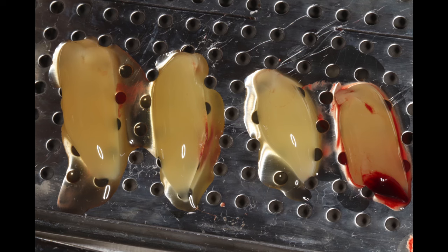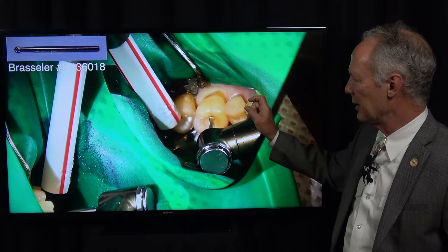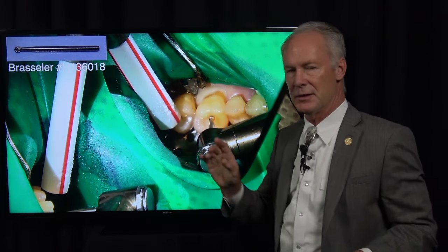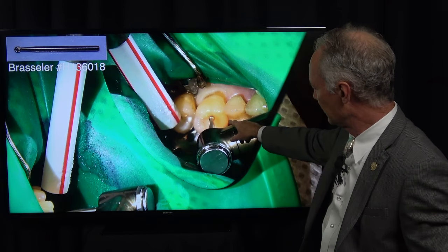You put the platelet-rich fibrin clots on this perforated tray, then put the lid on top of it and it squeezes the serum from the platelet-rich fibrin. This is a long shank, either number six or number four surgical burr, and I'm using that to section the tooth into three pieces.